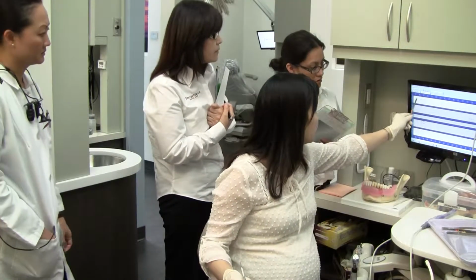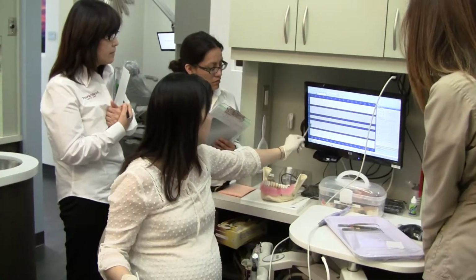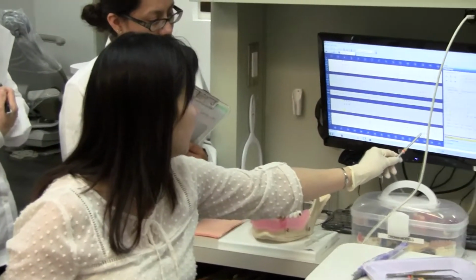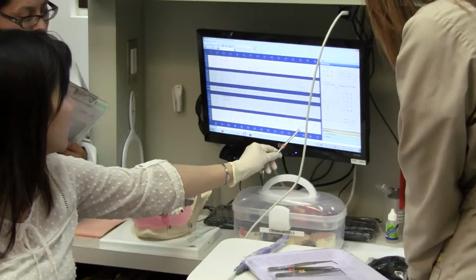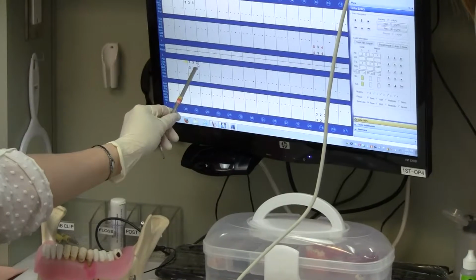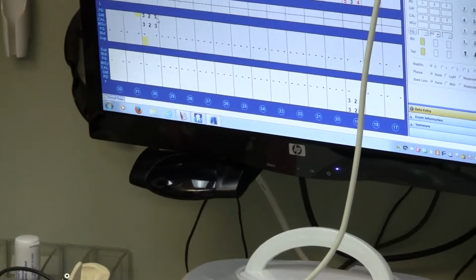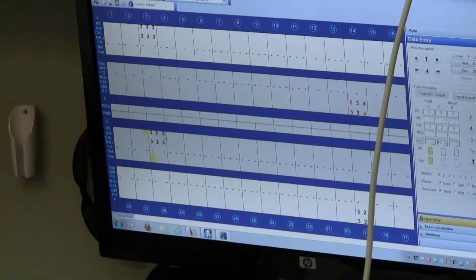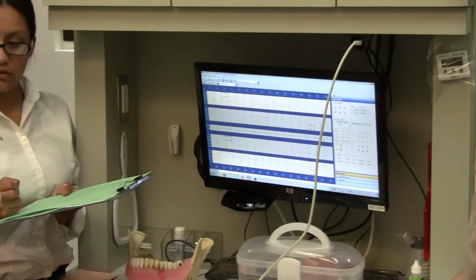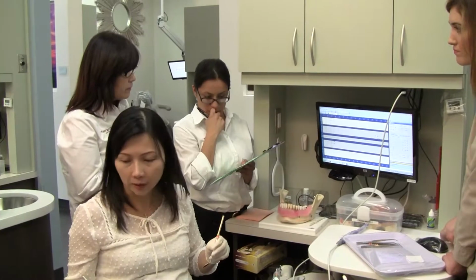So the way the reading goes, it goes this way, and it wraps around, right? And it drops down here, and it goes here. So if I read 19, I'm gonna read the mesial buccal first. So it starts right here. And then I'm gonna read 30, it starts from mesial lingual, and it goes here. And if you're not sure on that, just write down all the numbers, just the 4 sets of numbers. I usually do it right here on the corner. Okay, good. All right.